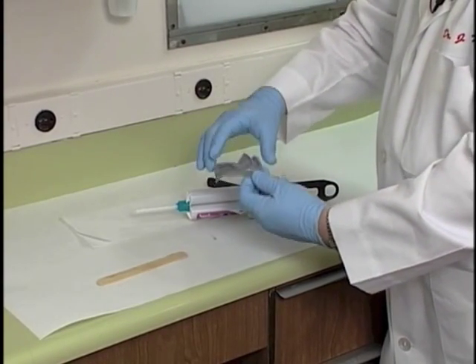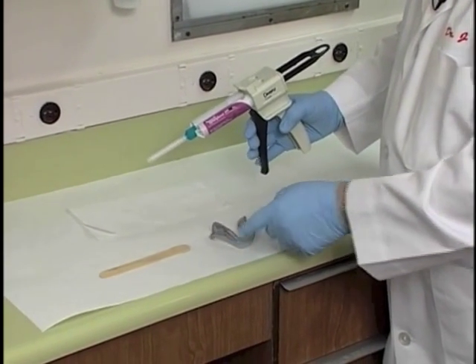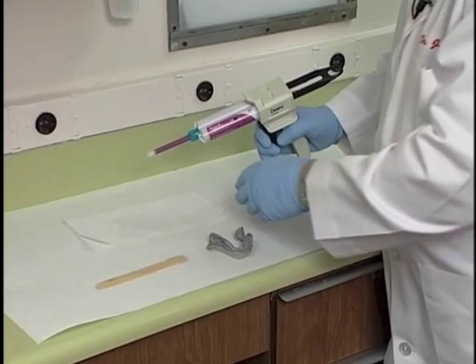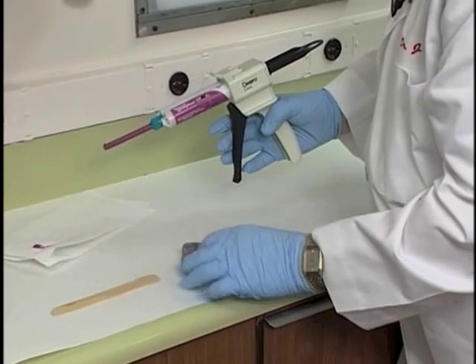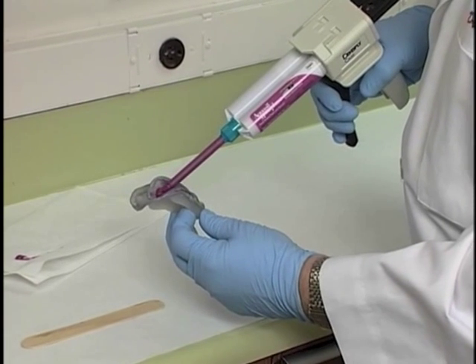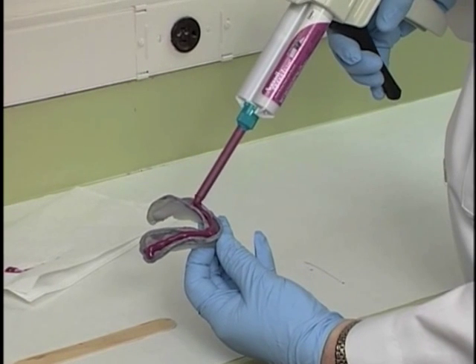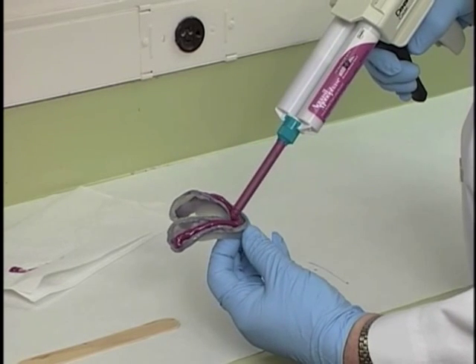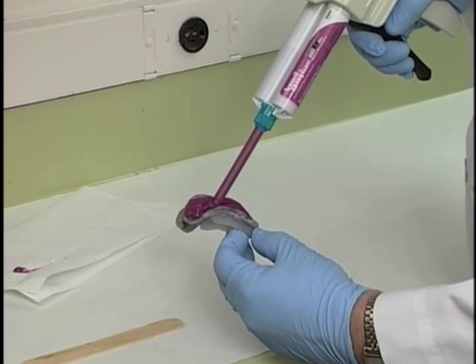We're now ready to apply the impression material to the tray, but before applying the material to the tray, I always like to squeeze a little bit of the material out of the mixing tip. I'll just get rid of that little bit for fear that it might have already started to set. And now we're going to just apply the material to the tray. I usually put about 3 layers of this material, or strings of it, whatever you want to call it.